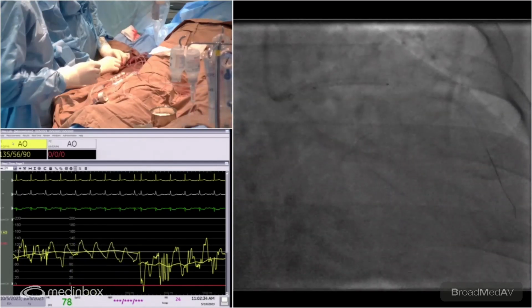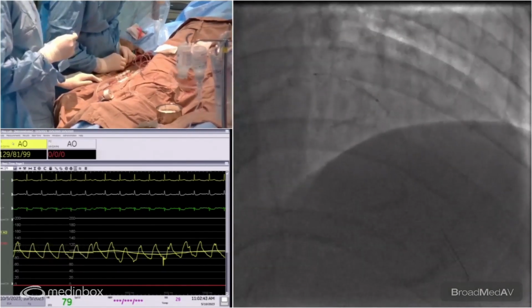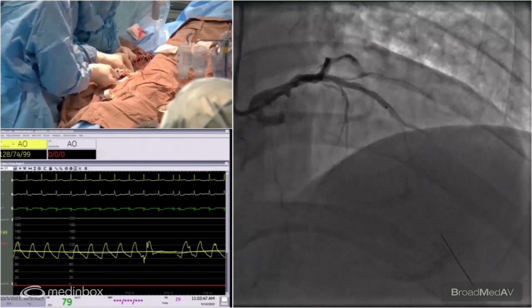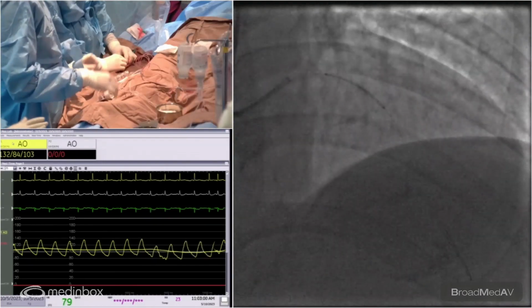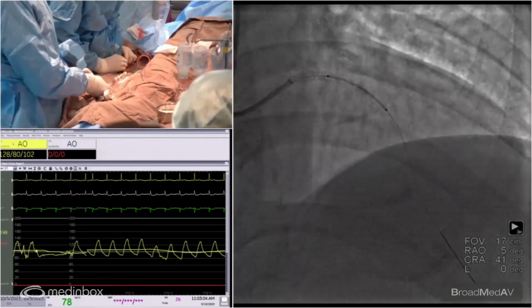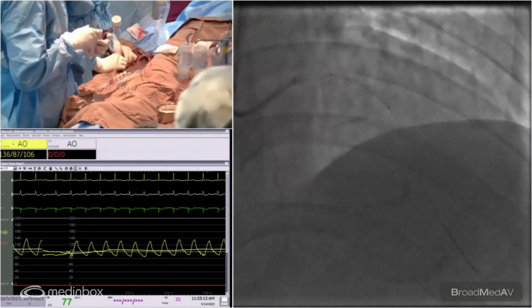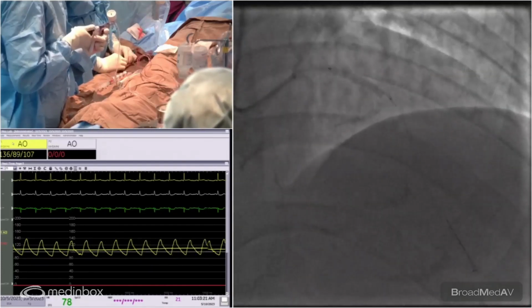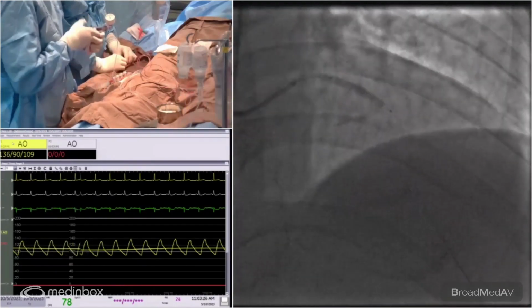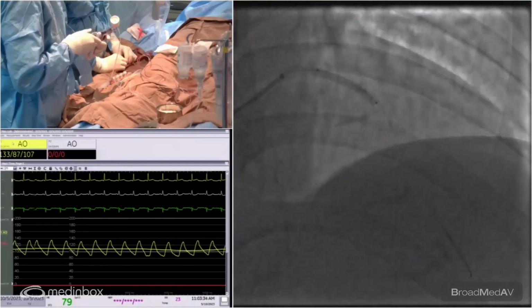Yes. Okay, on Cine here. Camera position. Should we, yeah, we can go a bit down. Yeah, that's good. I'll just see a small cine. That looks reasonable. So go up there, please. Yeah, go. So we'll now deploy the stent at normal pressures. And then we'll post dilate with the 3.0 balloon. Sister, can we prep the 3.0 balloon, please? Deflate. Once more. Once more. Okay. And deflate.